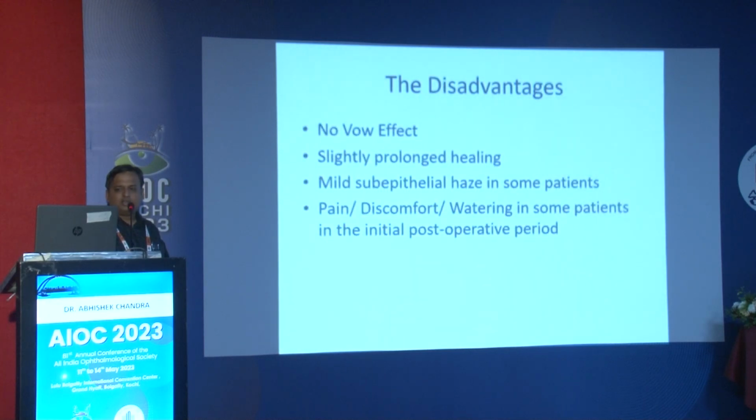So there are disadvantages, which I told you, was no wow effect initially, but usually in around 80% of the patients do not complain because once you put a bandage contact lens, usually the pain and other things do not happen. In very few patients this does happen, and then you have to counsel the patient.